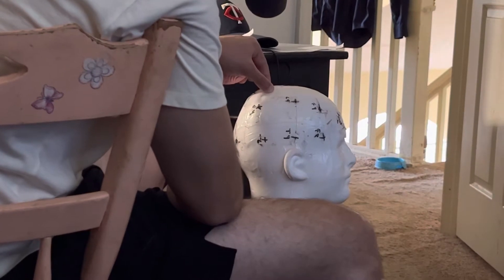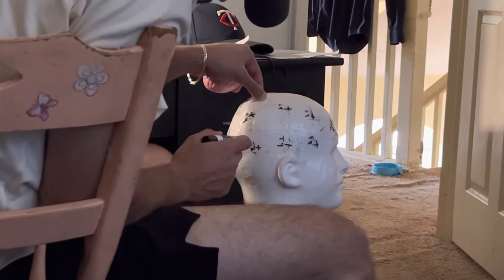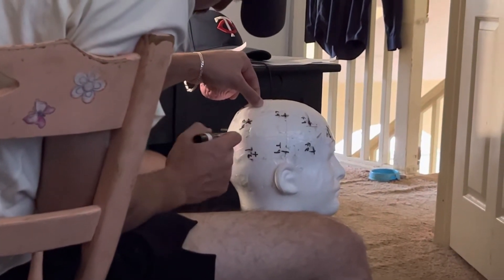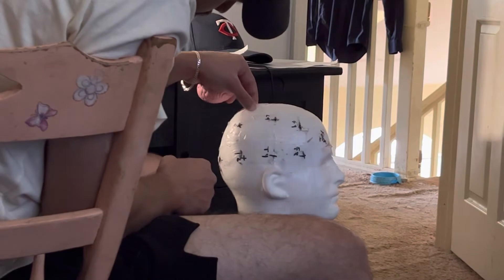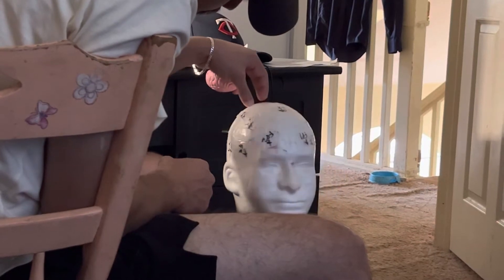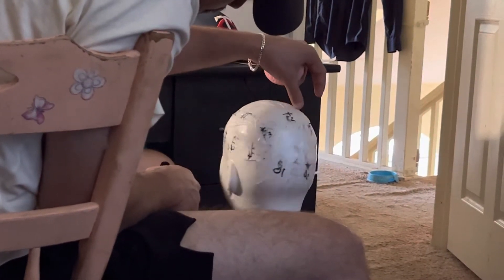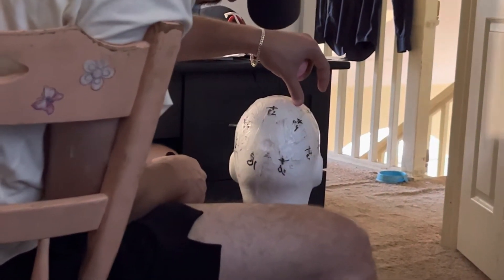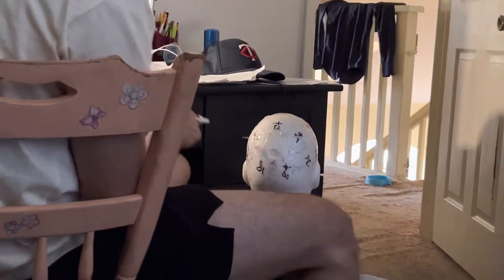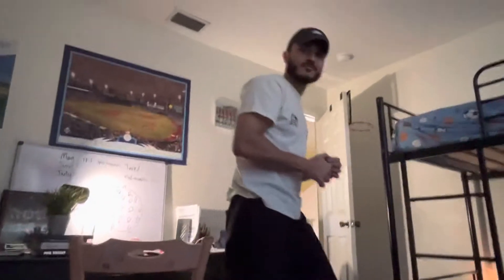Yeah, I think he's looking over his work right now. I'm doing a voiceover, so he's not listening to me. But yeah, he's looking at the head — I think he thinks he's right, so we're going to have to go up and check. Let's see if he's got them right.